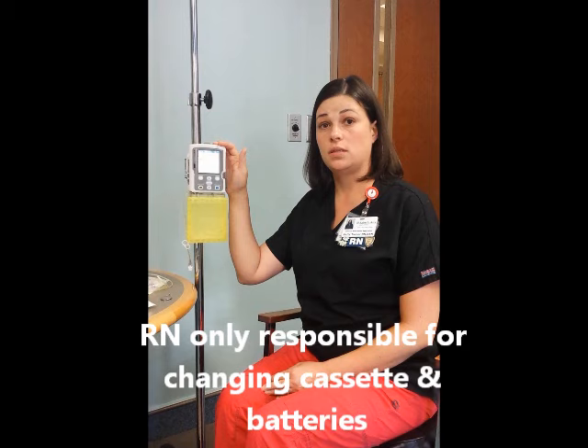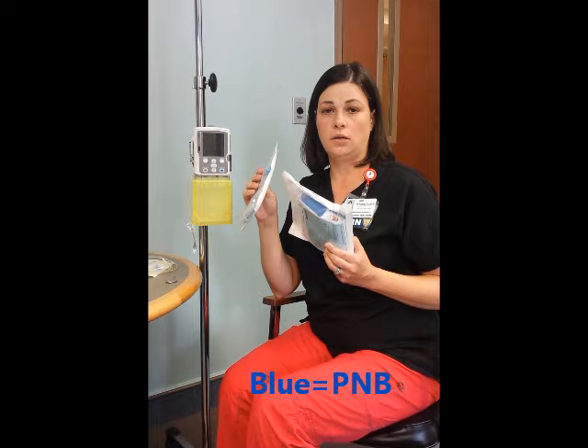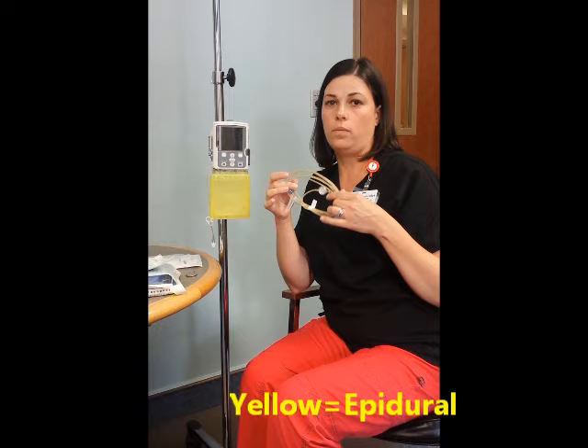Anesthesia will be responsible for initially programming the pump. They will also provide rate changes, any bolus that is needed, and they will also be responsible for DCing the pump. Nurses will need to know that blue cassettes and blue tubing are used for peripheral nerve blocks, and yellow cassettes and yellow tubing will be used for epidurals.